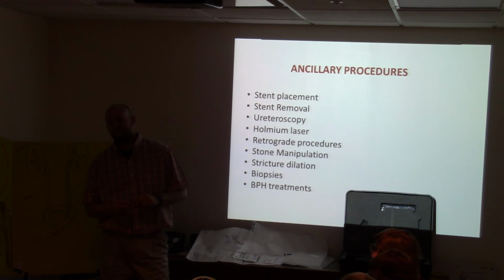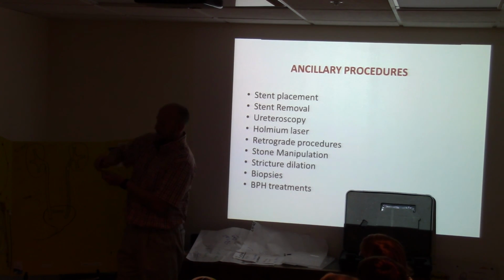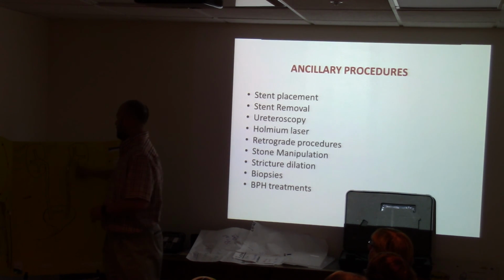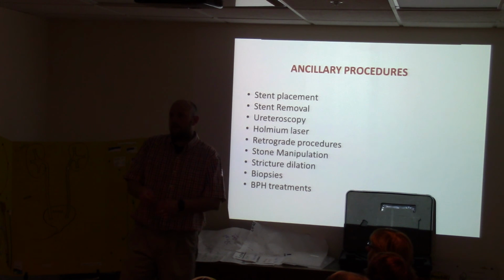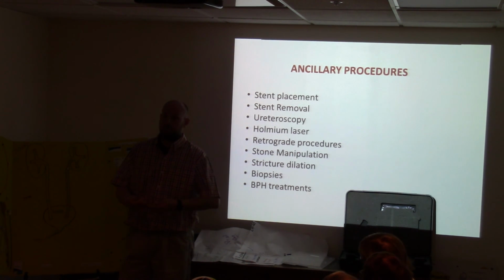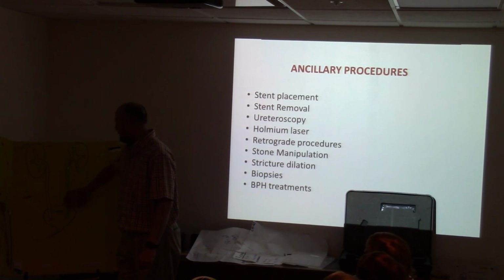How does the doctor determine the type of fiber he wants to use? The size of the holmium fiber is basically about flexibility. A smaller fiber, 150 or 200 micron, has the flexibility to go up and make bends, like if you're treating lower pole stones. As you get higher in number, like a 1,000, there's no way you'll ever get a 1,000 up that high. It's thicker, harder, more rigid, but you can put more energy through a 1,000 because it's bigger and more robust. So they use those for bladder stones. So basically it's 1,000, 550, 365s, 200s, or 150s. Okay.